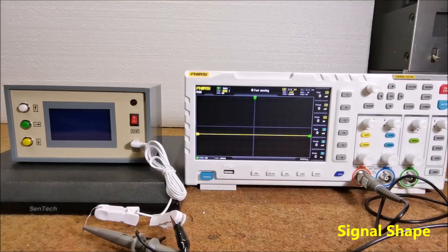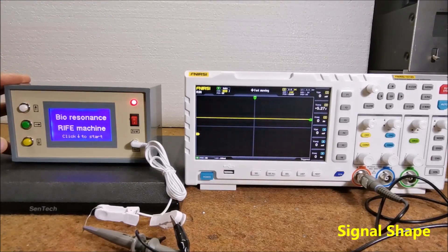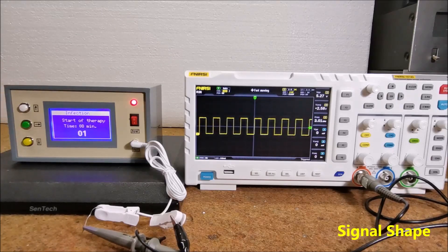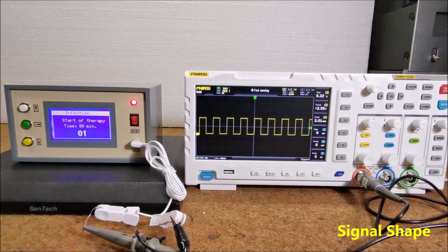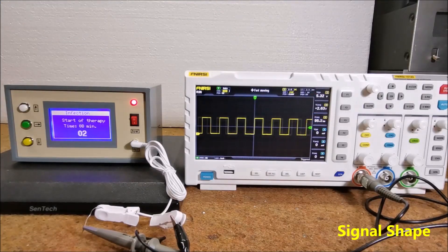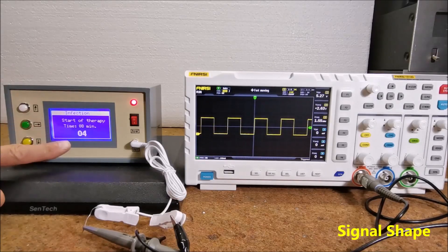Now let's look at the shape and frequency of the output signal on the oscilloscope. For each disease, the signal has different frequencies which change every minute of therapy. For example, let's look at some of the frequencies of infection therapy: minute one — a 3 kilohertz rectangular signal; minute two — 95.3 hertz; minute three — 820 hertz; minute four — a 1.55 kilohertz rectangular signal.